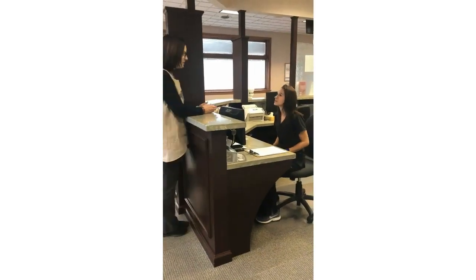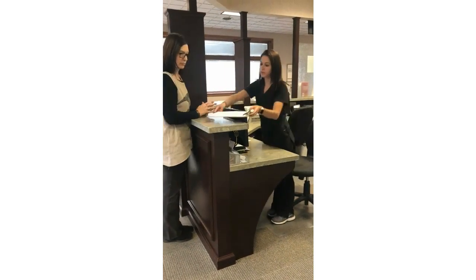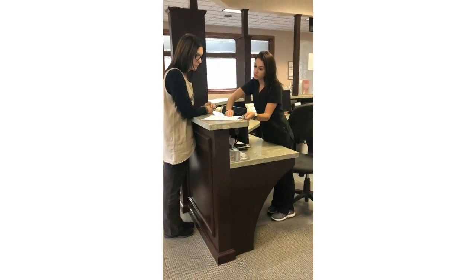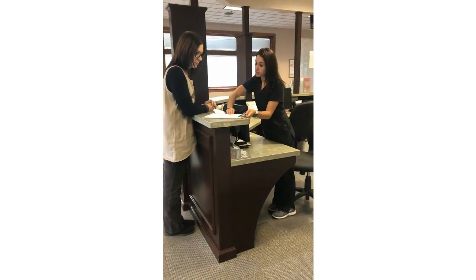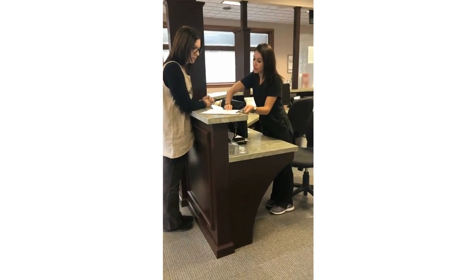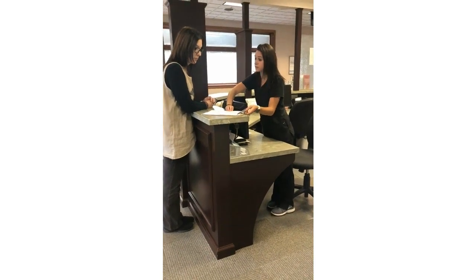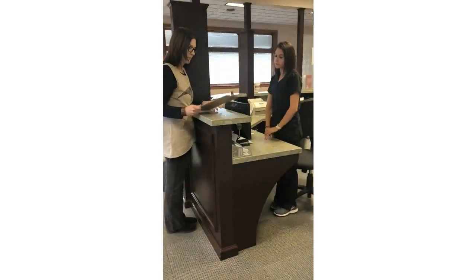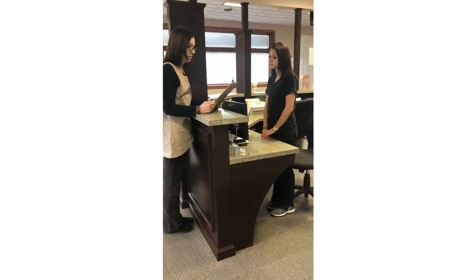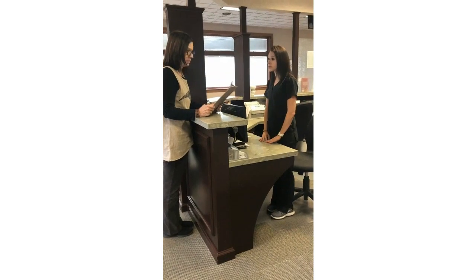Hi, can I help you? Hi, yes, my son and I are here for appointments. Okay, I just have some paperwork for you. This goes over the tests the doctors want you to have done each year as part of your annual exam. These tests check for holes, tears, detachments, and potential diseases starting. Even if you're not having any problems at this time, it can serve as a baseline for future reference. How long would this test take? The tests only take about 3 minutes total. And would we need drops? No. In some cases, they will.